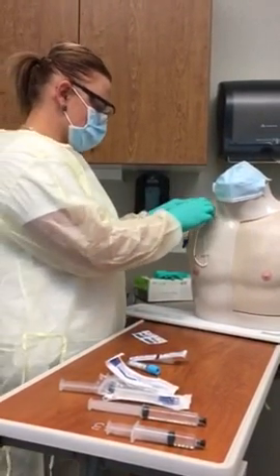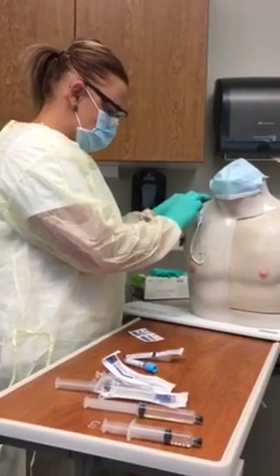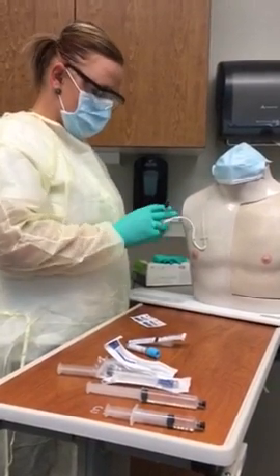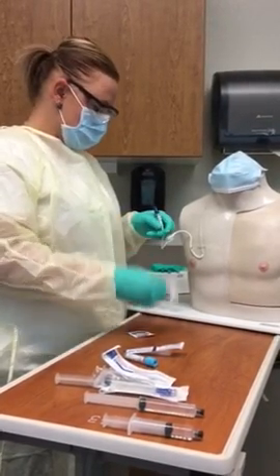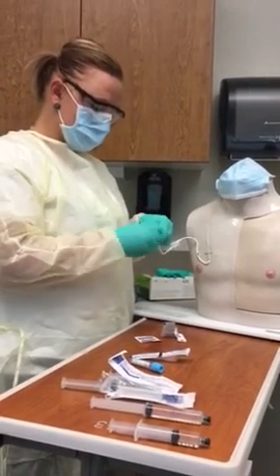So the first thing we're going to do is take this tape off your neck here. Alrighty. Sorry if that hurts. Oh, it's not near as sticky as that other stuff. Yeah, that's true. So the cap is already contaminated, so we want to make sure that we clean that nice and good for at least 15 seconds before we do anything with it. We're going to clean that real good with friction for 15 seconds.